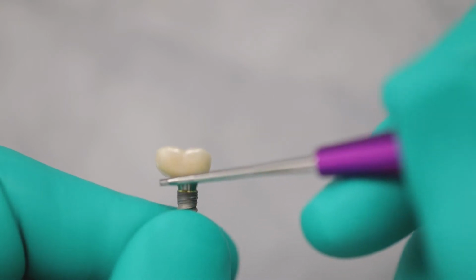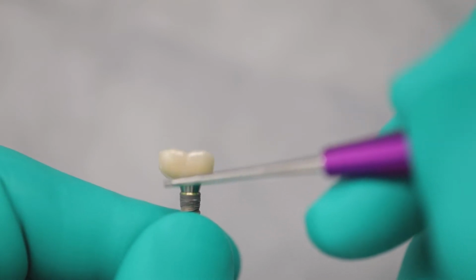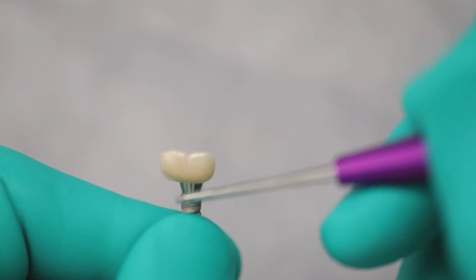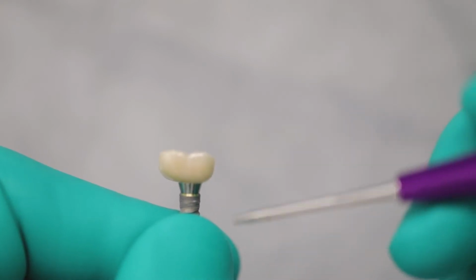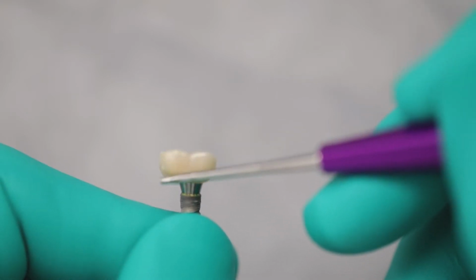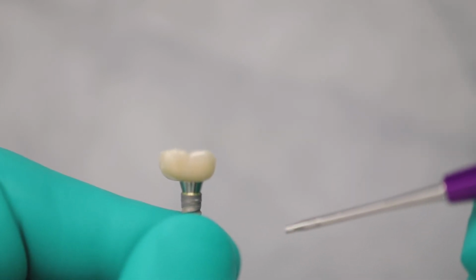Number one, it's very, very difficult for the patient to keep food from getting underneath here. Okay, so this is sitting right on the gum tissue up against maybe a natural tooth, and when you have this kind of distance on this cantilever here, you have a food trap, and the patients usually complain, wow, I really get a lot of food caught in there. And then they'll tell you if they do floss, they'll say, when I floss there, it's really weird because I go down and then it goes way over, and it kind of freaks them out a little bit. You do have to warn them about that if you have one of these kind of solutions.